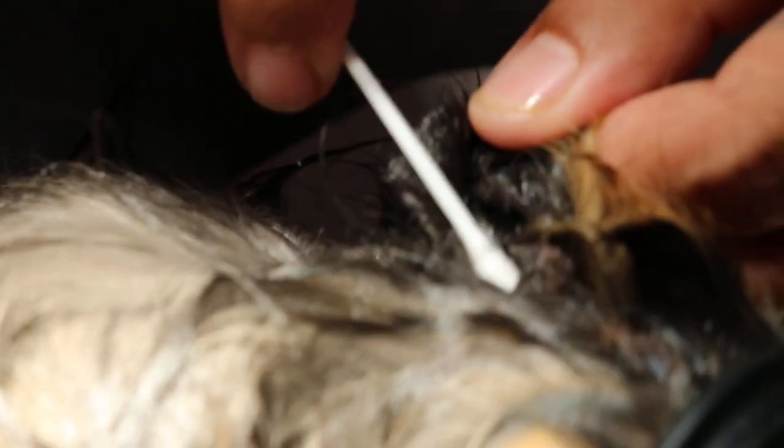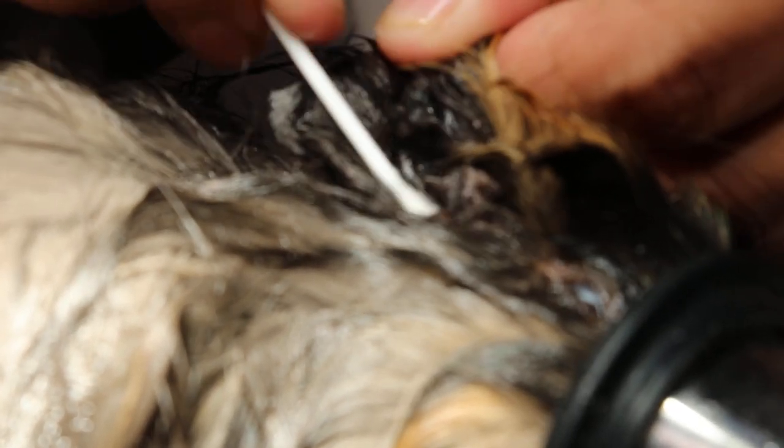It's a 5-month-old female guinea pig. What we do is irrigate the ears and get the dirty things out. It's okay already.